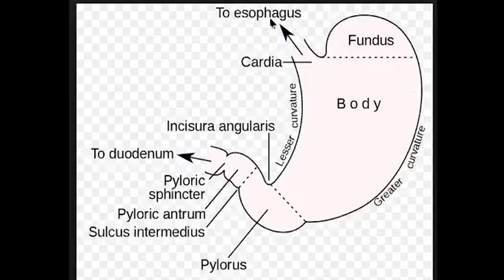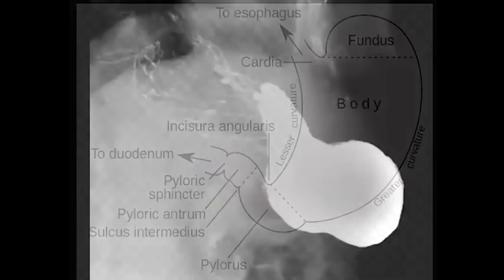This junction between the esophagus and the stomach is called the gastroesophageal junction. The first part of the stomach is called the cardia. During the upper GI, we can evaluate all segments of the stomach as well. Here we have the fundus of the stomach up here, and then this is the body. We have the patient rotate 360 degrees and acquire images as they rotate on the table.